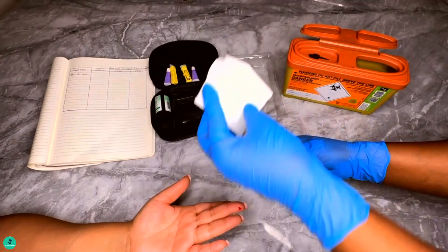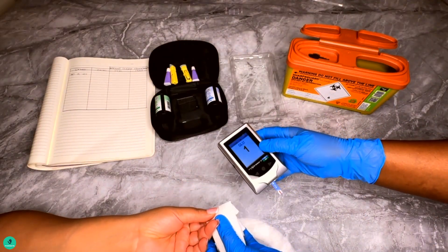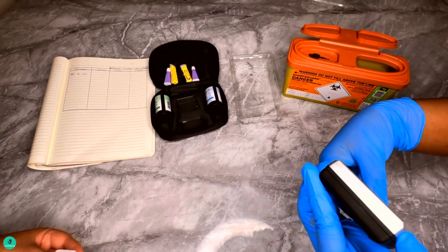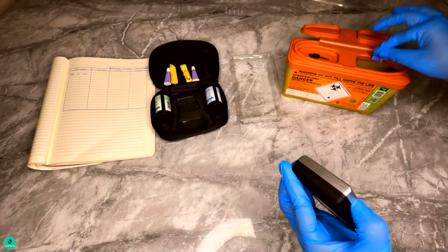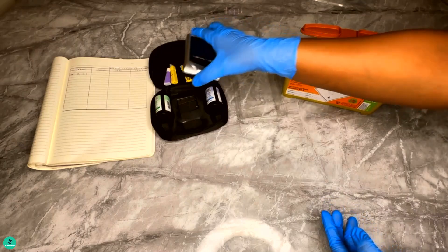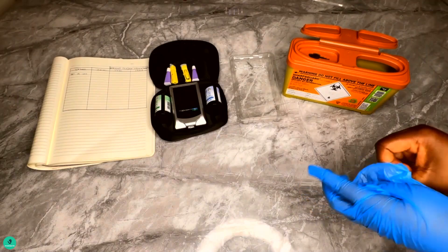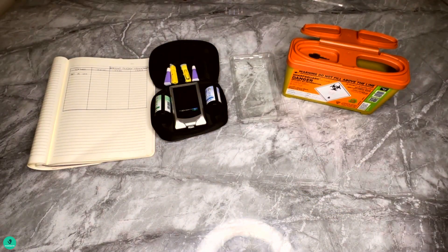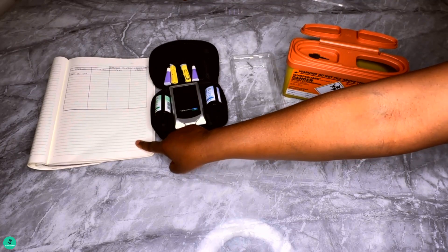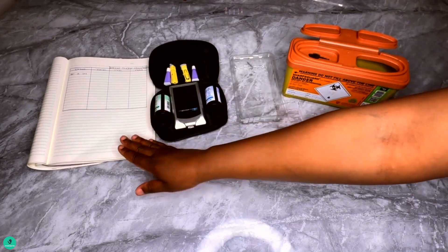Number seven: if the test is unsuccessful, please repeat from step four. Number eight: if the test is successful, clean any blood off your finger with the cotton wool or a tissue if necessary. Number nine: dispose of the test strip and ensure that the lancet used is put into a sharp bin.